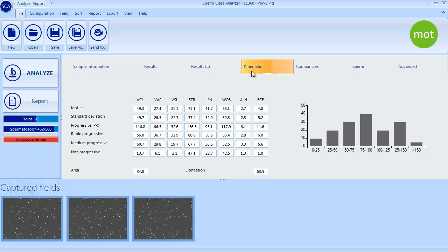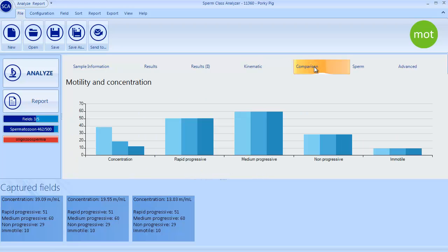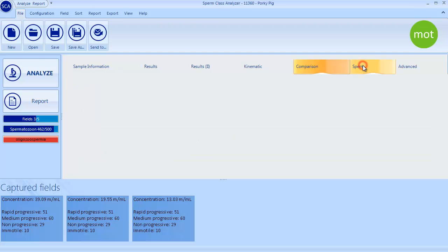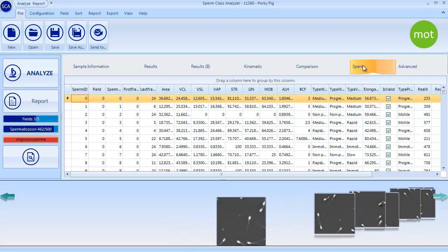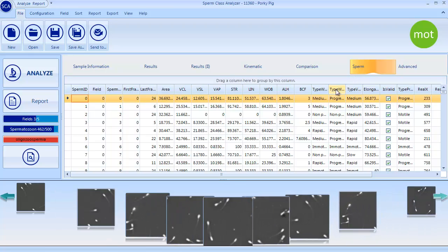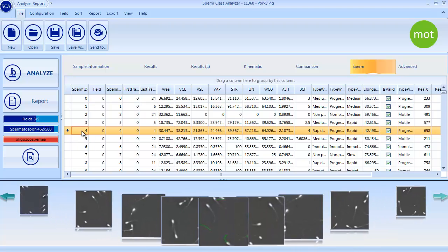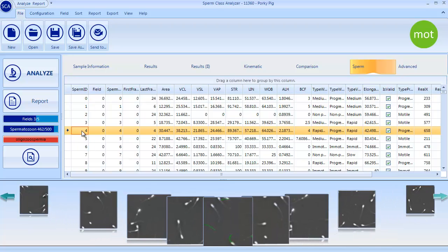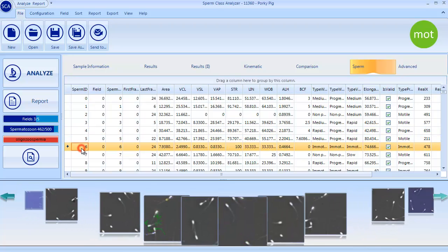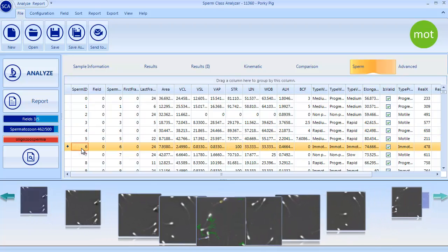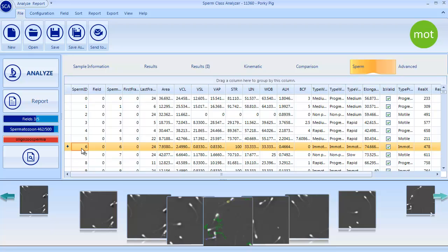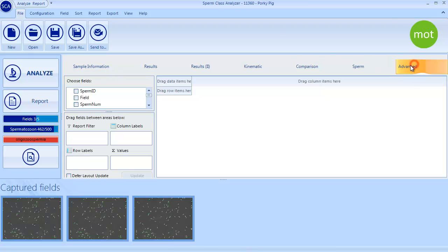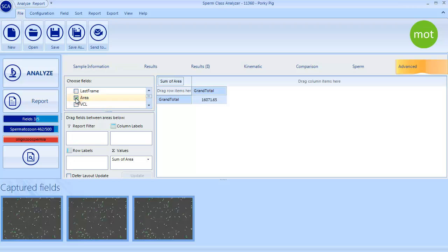Moreover, SAI provides the kinematic distribution of spermatozoa, a graphical comparison of the capture fields, a table with information of each spermatozoan, and finally a summarization tool where users can get any statistical data required.